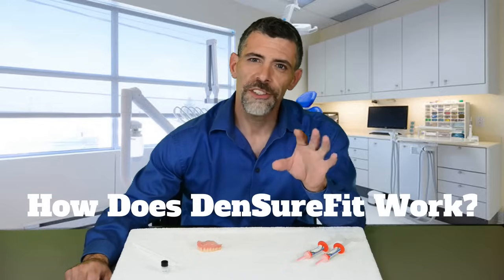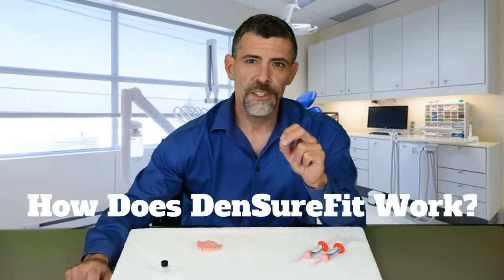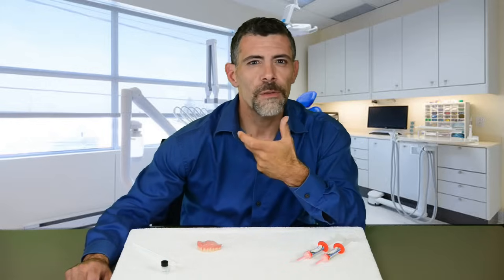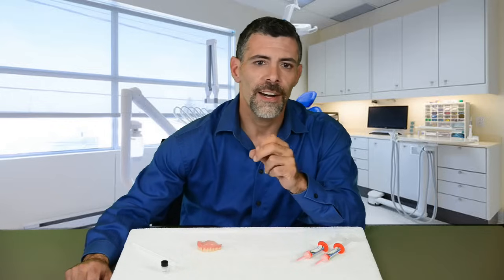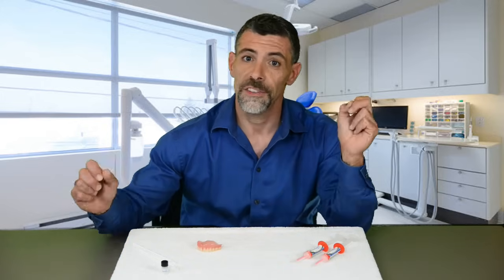Now, how does DenSureFit work? In order to understand that, we first need to understand how a denture works and why it gets loose. Dentures stay in place through suction. A perfect fitting denture fits snugly into the roof of your mouth and in the gum line area without any gaps. Dentures will get loose when your gums shrink, leaving voids in the gum line area, also known as the trough.